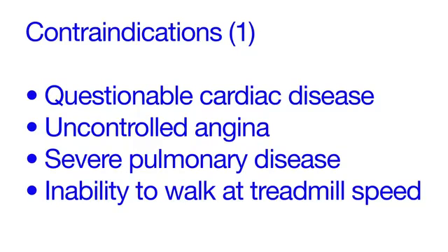Although this test is not as rigorous as a cardiac stress test and the risk of cardiac complications is small, it is appropriate that a written protocol be established and followed with regard to exercise contraindications, methods, and response to cardiac emergency. EKG monitoring should be used if available.